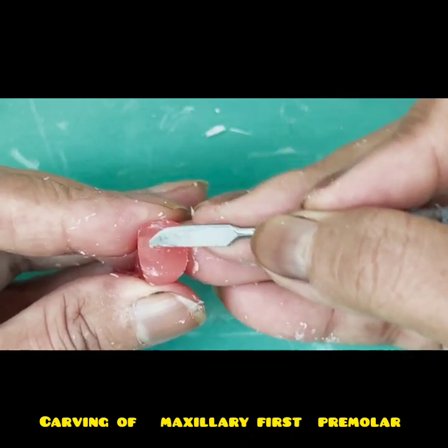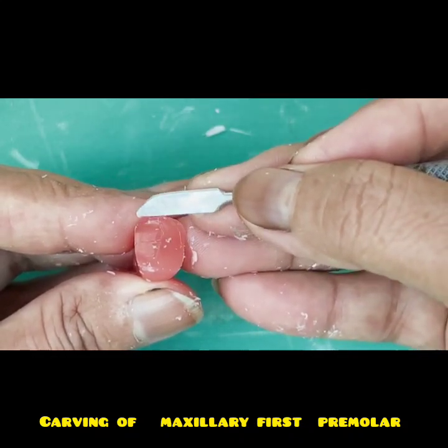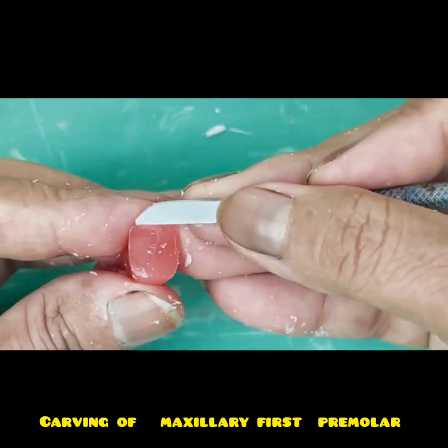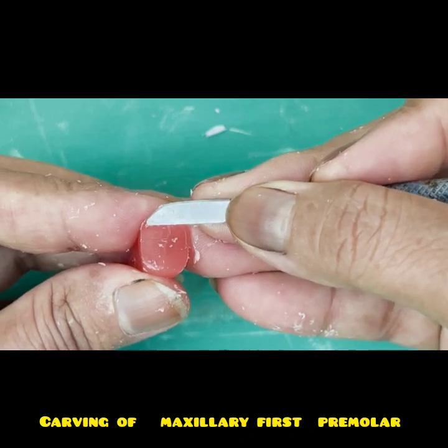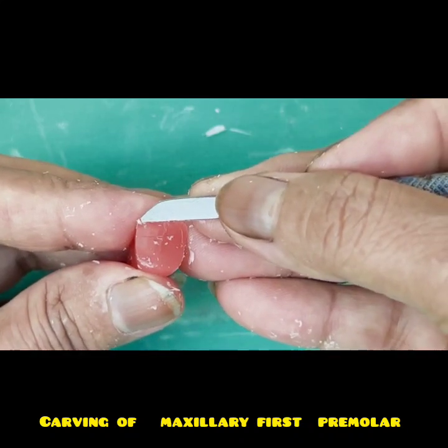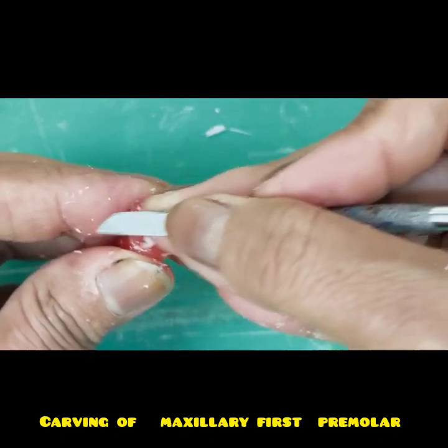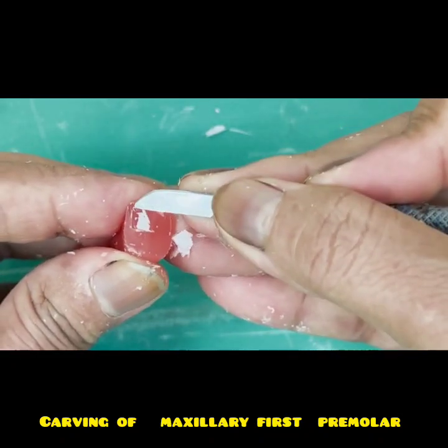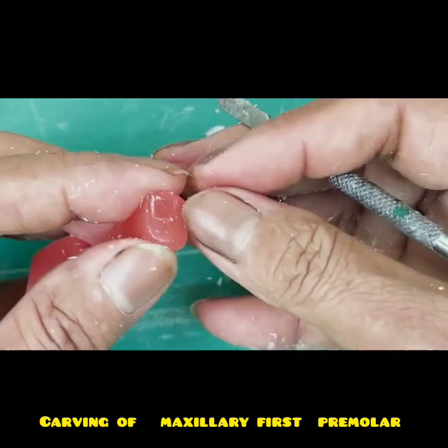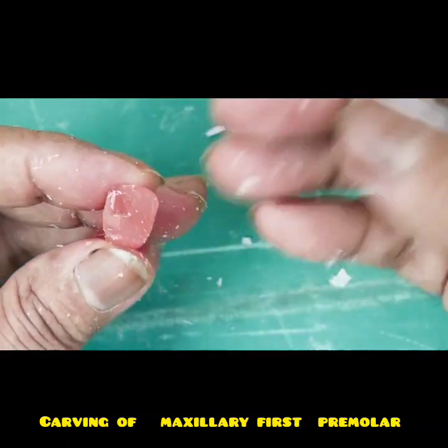and from here like a slide you move towards the center, so that you are creating a slide, and the slide will start from buccal and it will slope towards the central groove. Okay, so this will be my position of the carver, and see the angulation, it is more towards the mesial margin, it is an inclined position, right? And pressure should be more towards laterally and centrally, and don't remove this central ridge. Okay, so you can make out I have created an inclined plane and the slope.